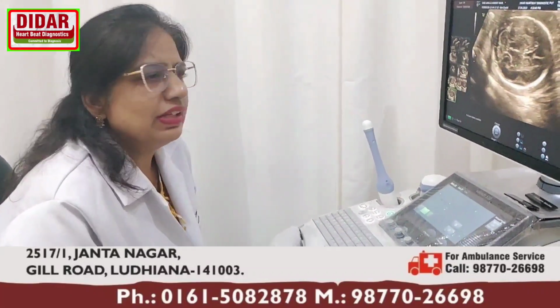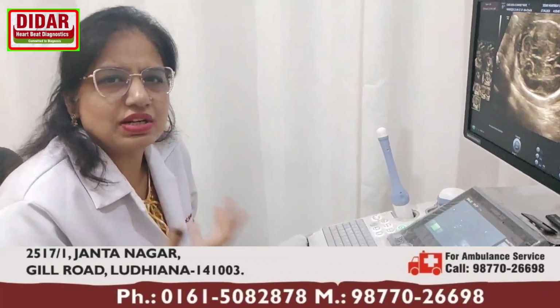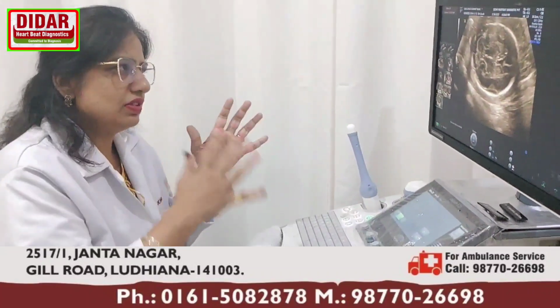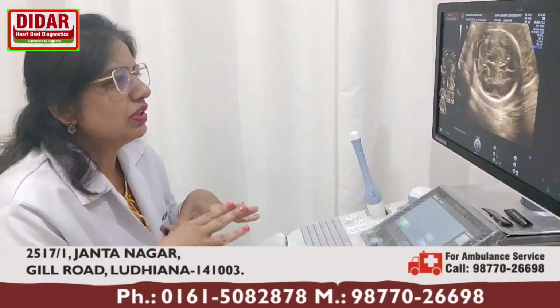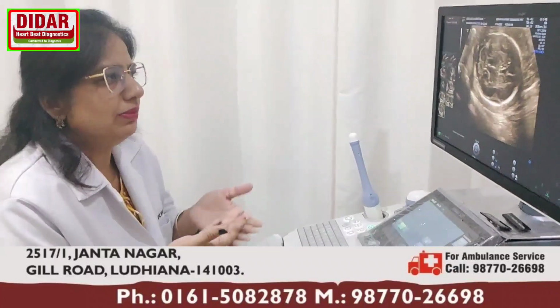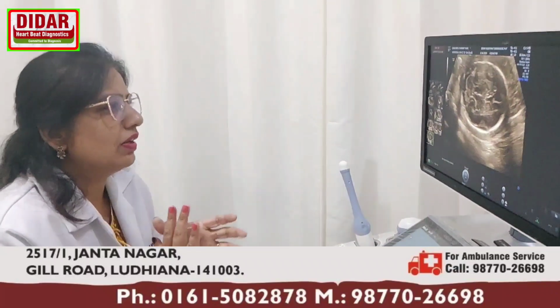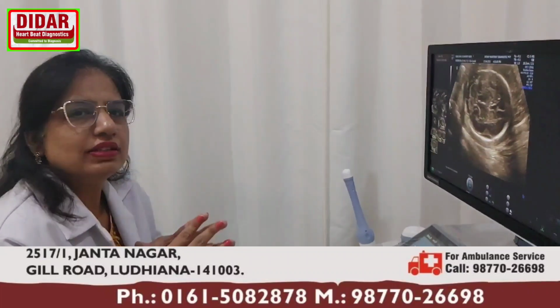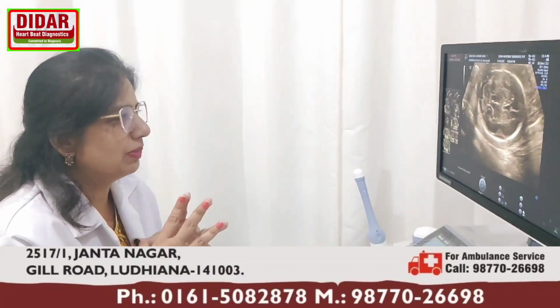Here it is very important to understand that a level 2 scan is basically to see structural malformations. So when we say the level 2 scan is okay, normal, it means the majority of the structures are well formed in the baby. There is no malformation. But all kinds of genetic problems cannot be visualized on ultrasound. So 75 to 80% of problems we detect on scan. The scan is not 100%.